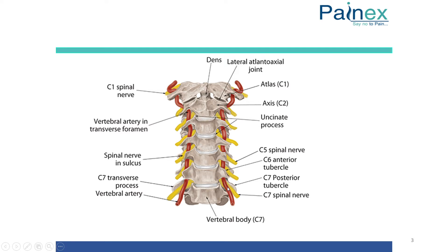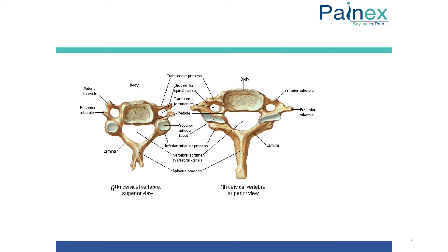As we move our probe up, the vessel that appears and disappears around C7 represents the vertebral artery or vertebral vessels. I will show it on the ultrasound. Here we can see this is C7 — why? Because only the posterior tubercle is seen and the anterior tubercle is almost rudimentary. At C6, we can see a prominent anterior tubercle and posterior tubercle.